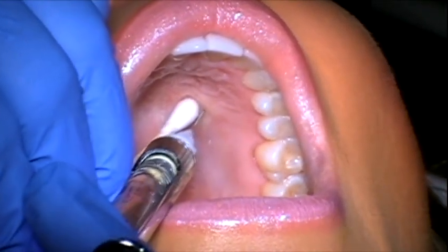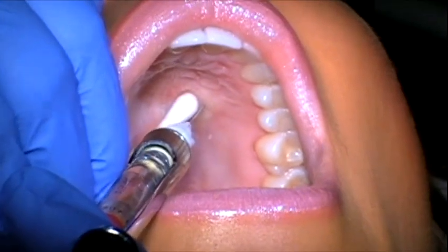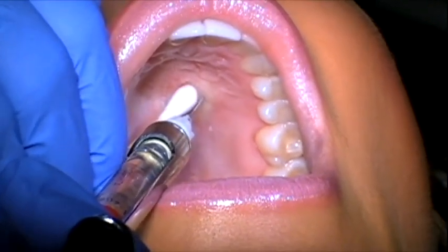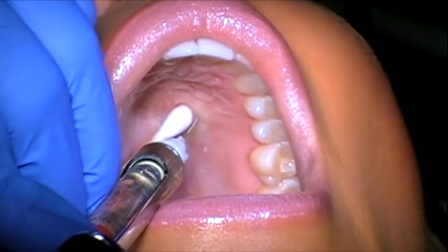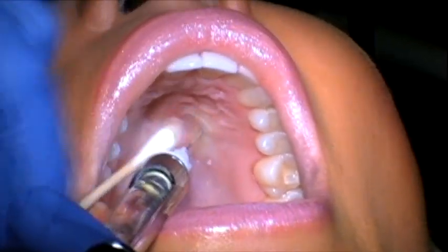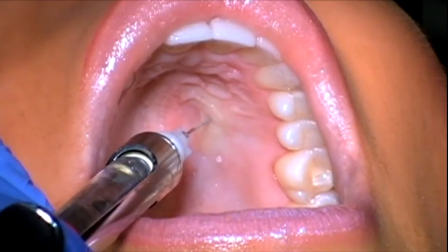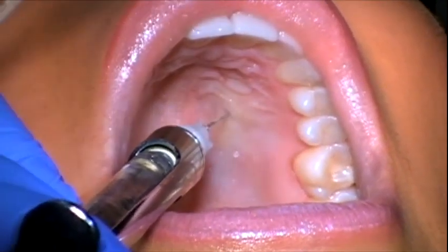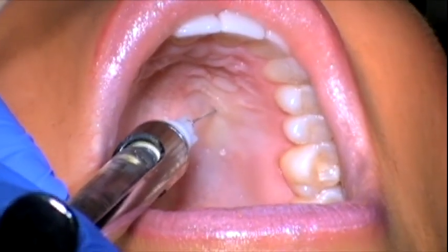I'm going to sneak the syringe in, give some drops on my way in, then contact, aspirate, and continue. You're going to start to see a lot of blanching. You have to go pretty slow on this one because we're going to end up depositing three-fourths to one entire cartridge on the palate. You don't want to give more than a third of a cartridge in less than a minute, so the rate is about a third of a cartridge per minute. I've already told the patient they're going to need to stay open wide for quite a while.